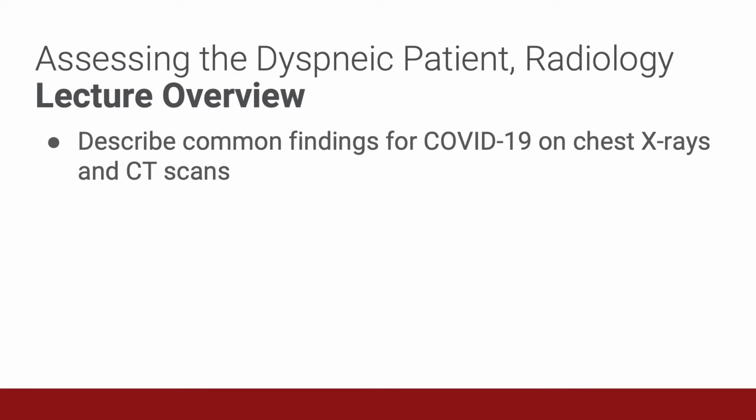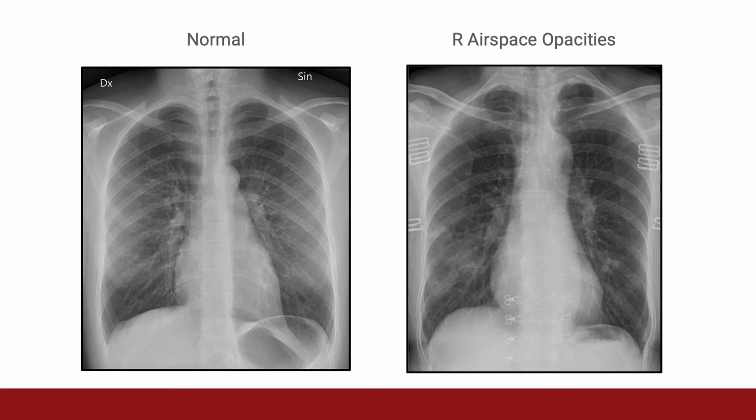In this talk, we're going to discuss the radiologic tests that can be used by healthcare workers in evaluating and diagnosing patients with COVID-19. We'll focus on the most common findings for COVID-19 on chest X-ray and CT scan. The chest x-ray is, of course, a critical tool in the workup of the COVID-19 patient.